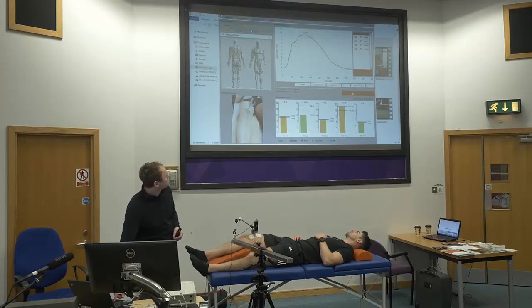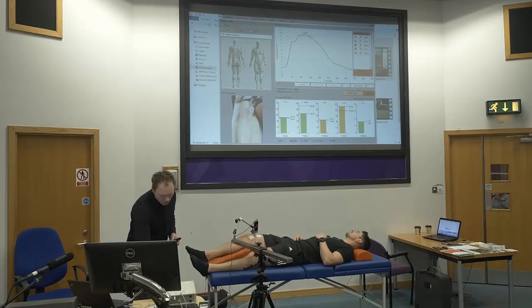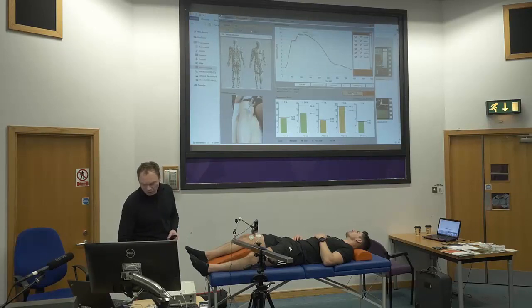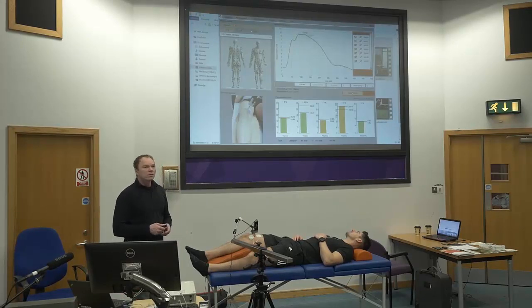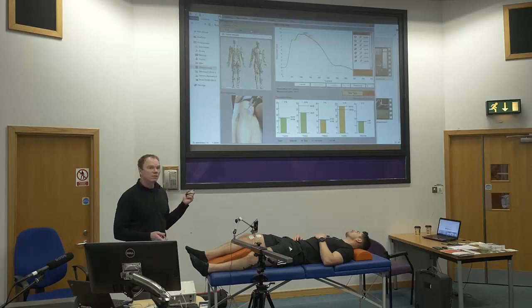Measure again — still some difference here. What you want is complete overlap up until the first part of the curve. If there is some difference later on, we're not so concerned, but the first part should be completely the same. Still a little bit of difference, not a big one — probably need one more. And that's it: we went from 70 to 80 mA, and now we got complete overlap of the two curves. Even if I would continue, I would get the same response.